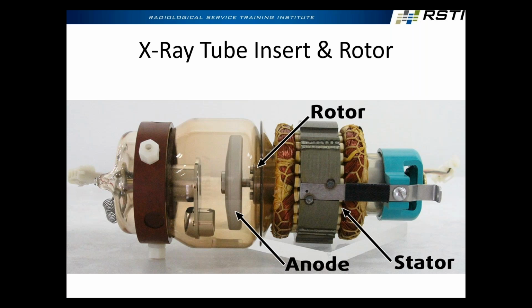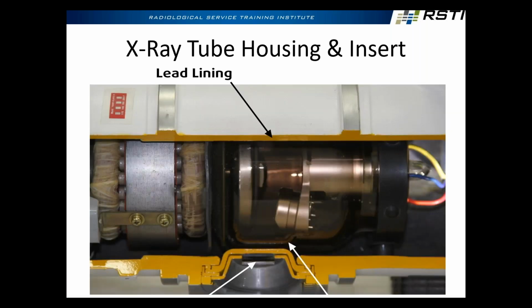Which brings up another point. One of the phrases that we use all the time when installing systems is don't drop the baby, right? Don't drop the baby. So if you ever take an X-ray tube out of its shipping container and it sounds like a slushy maraca, don't bother installing it. Something bad happened to it on its way to the forum.